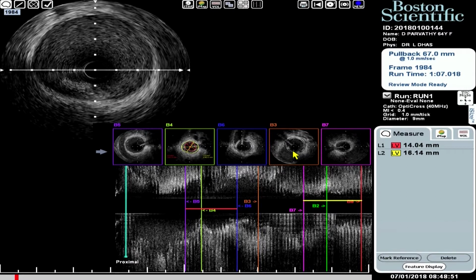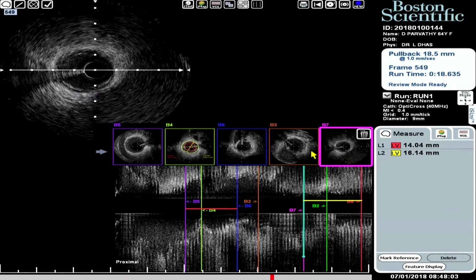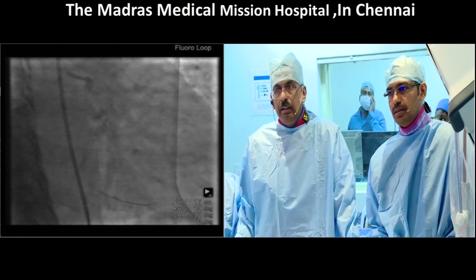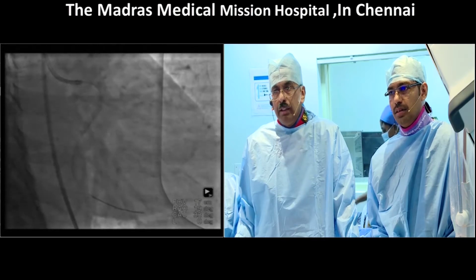And yes, we were prepared well and deployed the stent and did not post dilate. And approximately, we put a 2.75-18. Let's go forward. So this is a 2.25-18 Onyx distally and a 2.75-18 Onyx proximally. So this is what we have finished now. And we post-dilated the stent proximally with a 2.75 up to 20 non-compliant balloon.